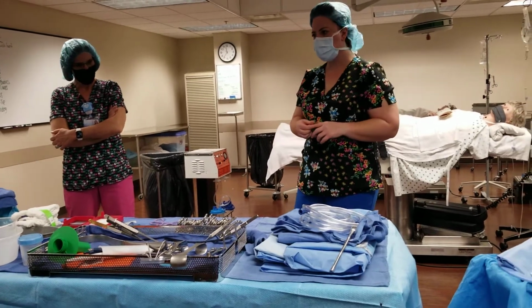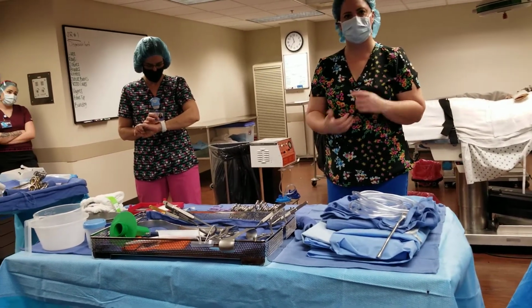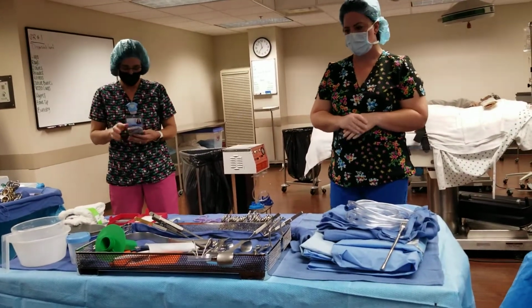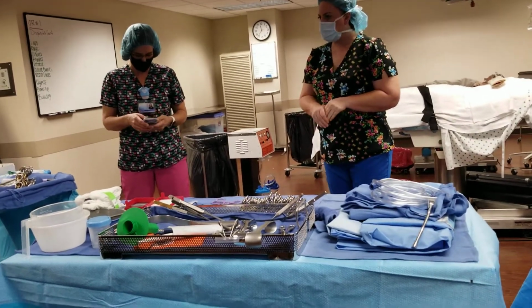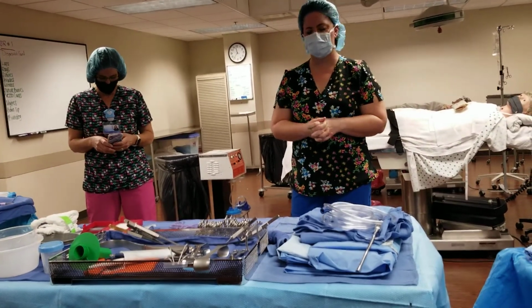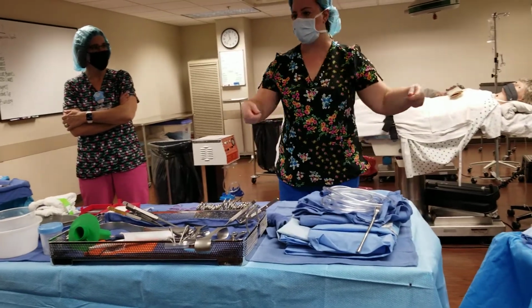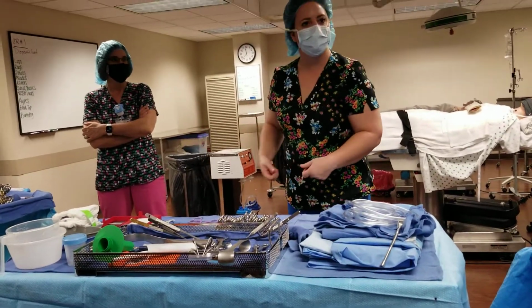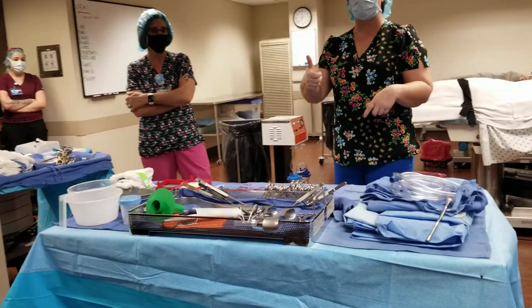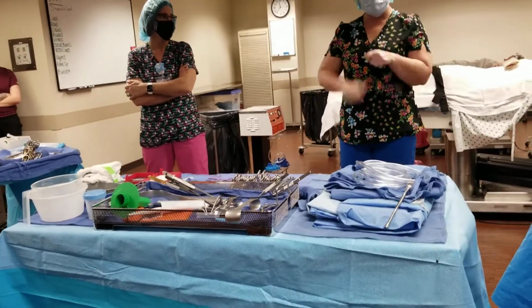If it's an emergency C-section, then scalpel, sponges, some suction. I've done one real, true emergency C-section. They called, we have an emergency C-section. It's usually not like they're rushing them in, but this time they were. I had just barely gotten the supplies, and I'm walking into the room, and they almost mowed me over. It was just bust open my pack, jump into my gown and gloves, just have a scalpel to get in, some sponges, some suction. We didn't even put up the Bovie. He just, with decreased fetal heart tones, cut all the way down, got the baby out.